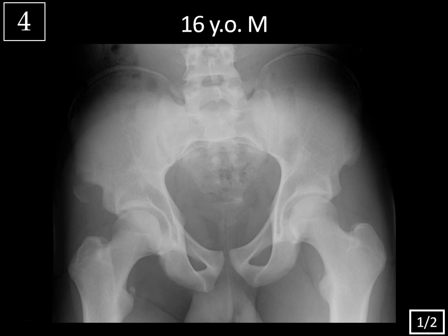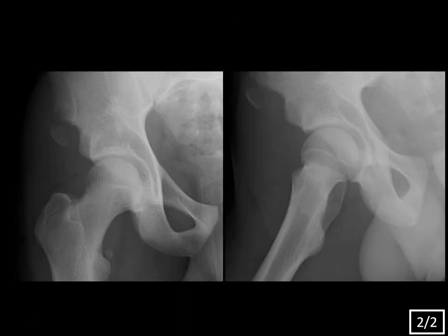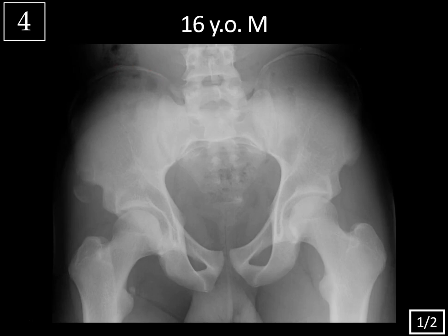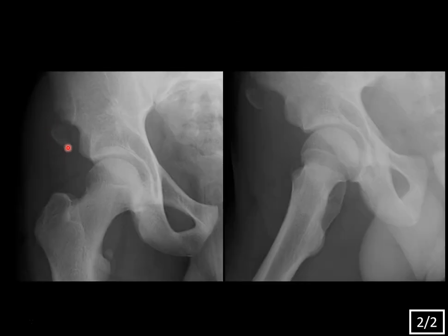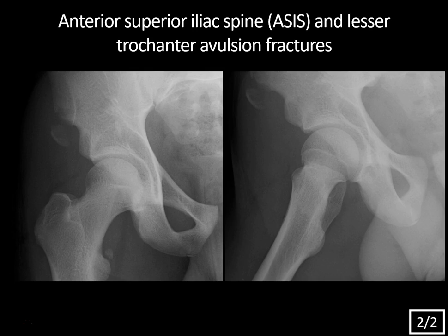Case 4, 16-year-old male. On the frontal view of the pelvis, the iliac apophyses are open, which is normal at this age. There is an asymmetric bone fragment adjacent to the anterior inferior iliac spine, and another apparent bone fragment adjacent to the lesser trochanter which also looks asymmetric. On cone-down views of the right hip, we can better see the avulsion fragment from the anterior inferior iliac spine. The lesser trochanter fragment appears more chronic due to corticated margins, while the anterior inferior iliac spine fragment is more acute with an ill-defined contour along the donor site.